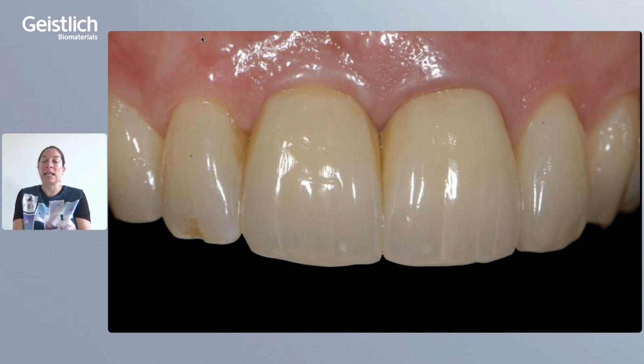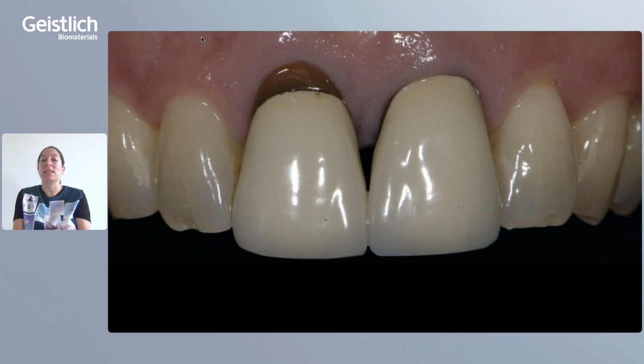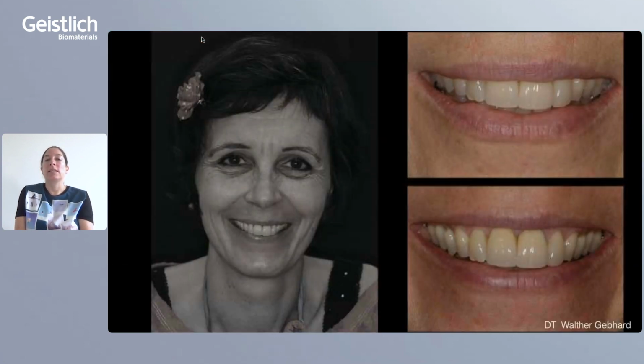And on the next slide, I show you the situation the patient did come to the practice with. So this was really the situation. Already the patient had a buccal resorption, and with this type of atraumatic tooth extraction in site 1-1 and the ridge preservation procedure and the longer healing period, we were able to come to this, I think, very aesthetic clinical outcome. And we had, in the end, a very happy patient.